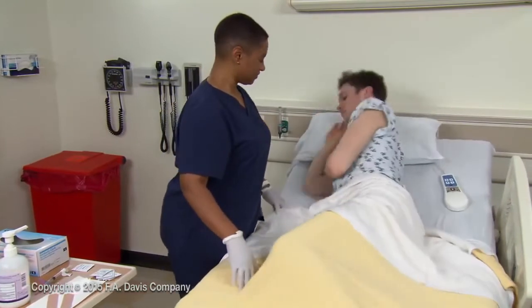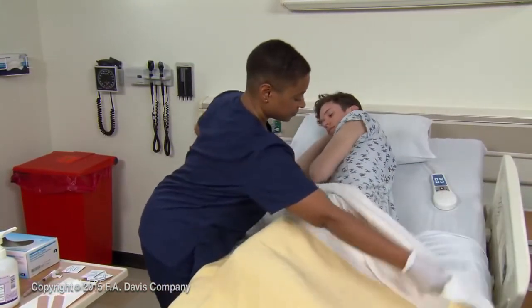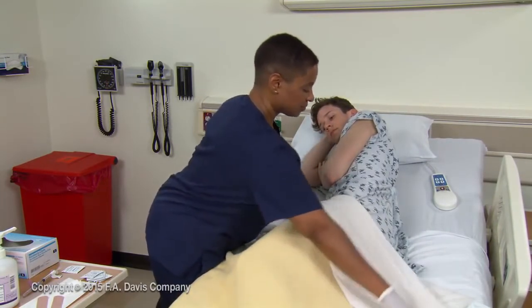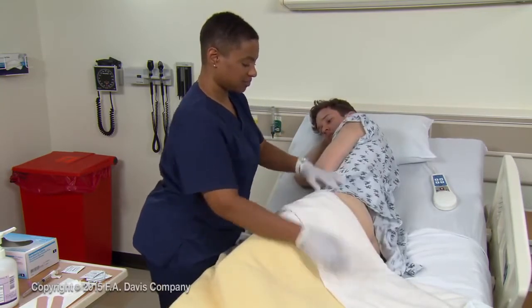Position the patient so that the injection site is well exposed and the patient is able to relax the appropriate muscles. For the ventrogluteal site, position the patient on his side with upper hip and knee slightly flexed. Be sure the lighting is adequate.